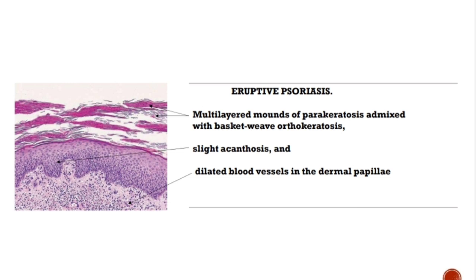There is a term used for the papilla in psoriasis which is known as the squirting papilla, which is basically a histological finding in which the neutrophils are seen migrating from the dermal papilla into the epidermis. As histological findings vary in the various stages and forms of psoriasis, the most reliable sign of psoriasis will be the dilated and tortuous papillae, which is present in almost every stage and form.